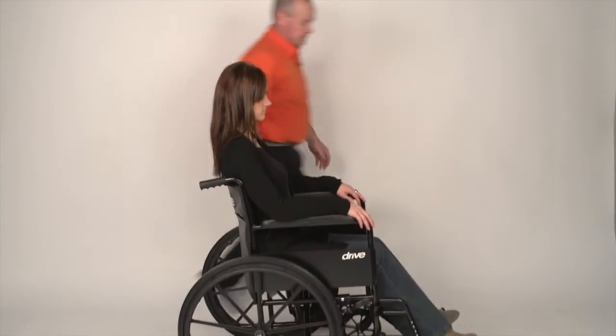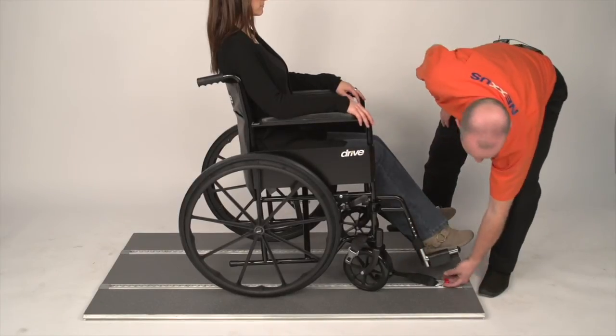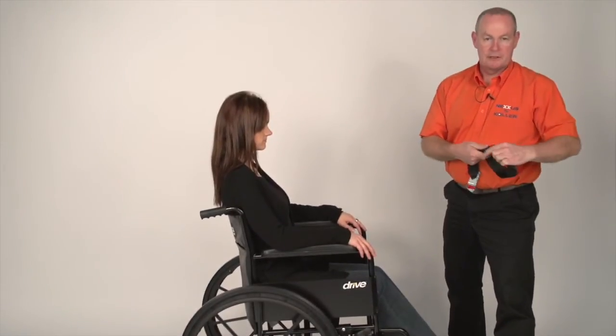For the front straps, undo the tongue from the buckle, remove the clip, and put the tongue back into the buckle.